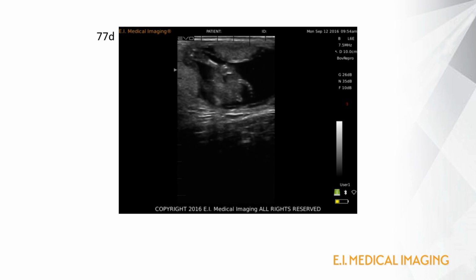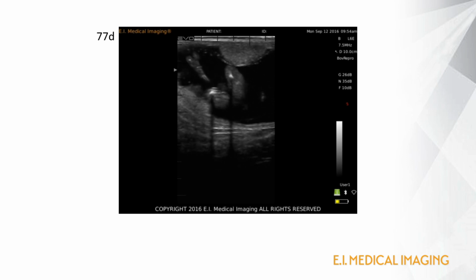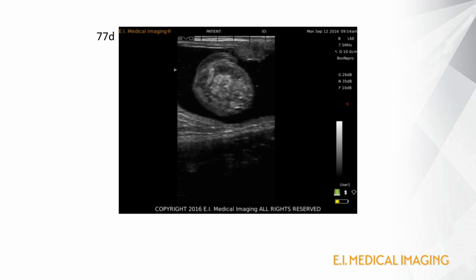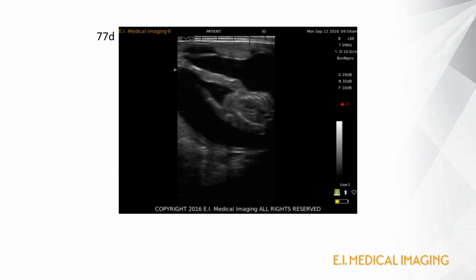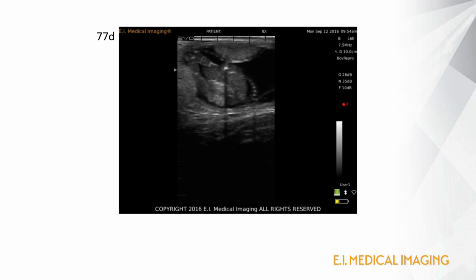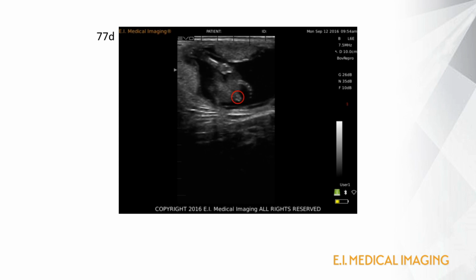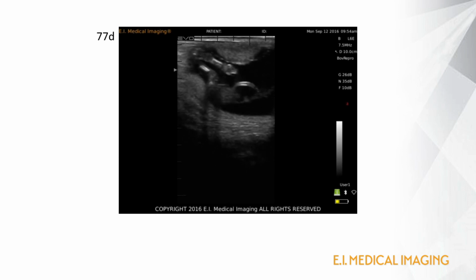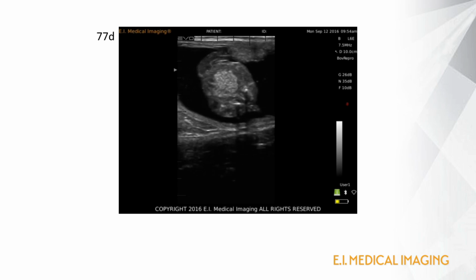While this is still a mostly transverse view, it's slightly obliqued, and this heifer calf is a little further along and turned upside down, with her feet pointing up toward the transducer. At the beginning of the clip, you can see the highly echogenic vertebrae of the tail, as well as a distinct female GT. The umbilicus overlaps with the abdomen as we scan forward, but there's no male GT seen.